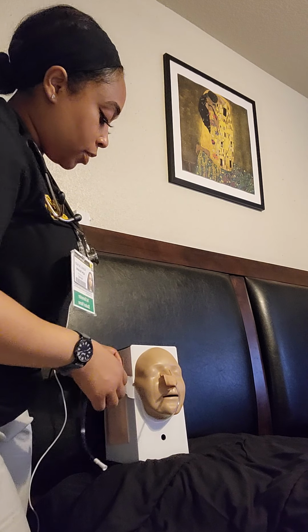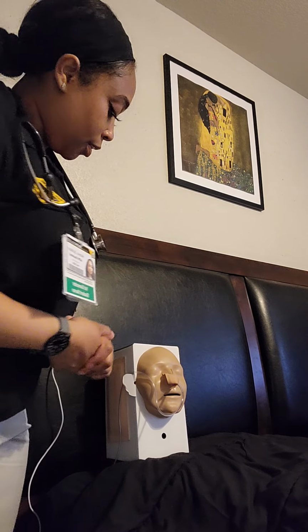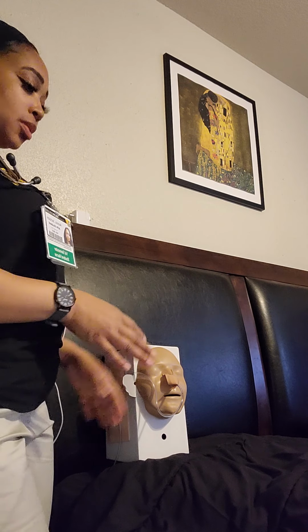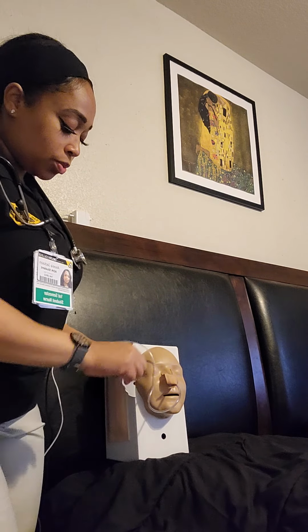I will note how the patient tolerated the feeding as well. And the patient will not be connected back to suctioning, so there's no need to connect that back. So I'll make sure to cap the end of the NG tube.